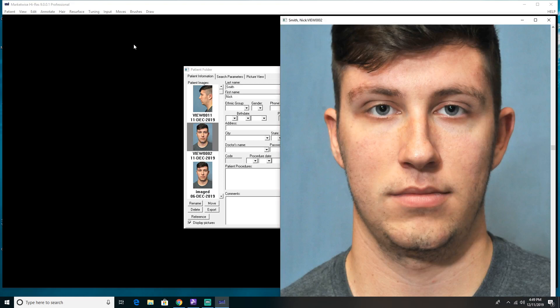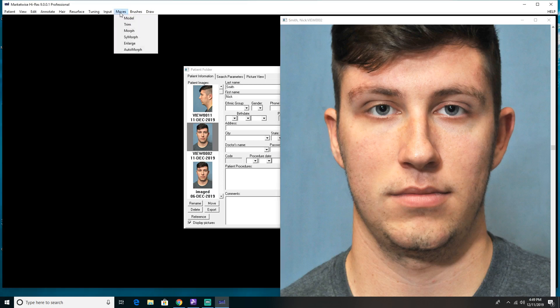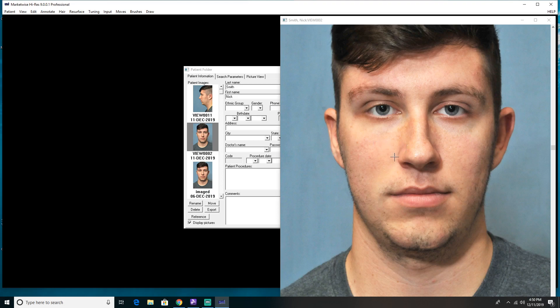What I generally do is I start off with morphs, moving the big areas first and then going down to fine tune the details. So let's go up to the top banner under the Moves drop down and choose Morph. I'm going to go over to my patient picture and I now have the little plus sign with the crosshairs. I'm going to make boxes and within the boxes I'm going to push the pixels to move these areas on his nose.